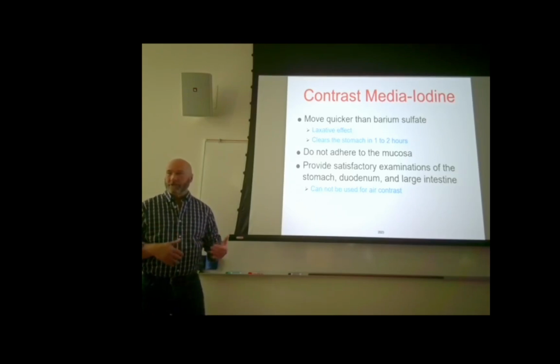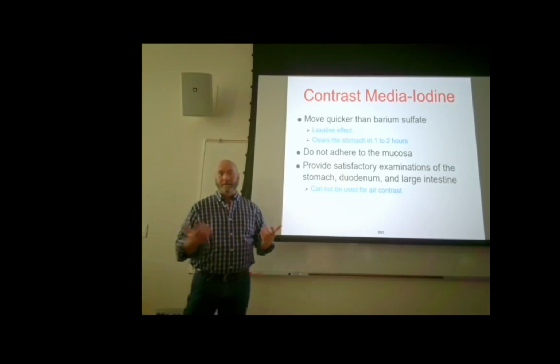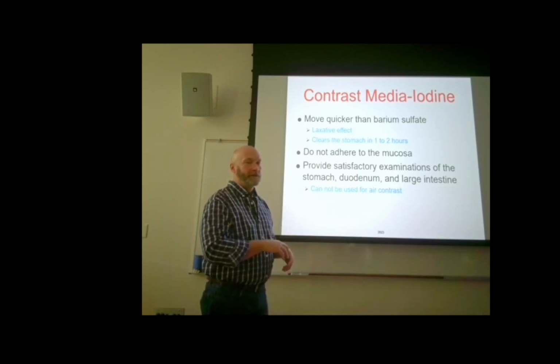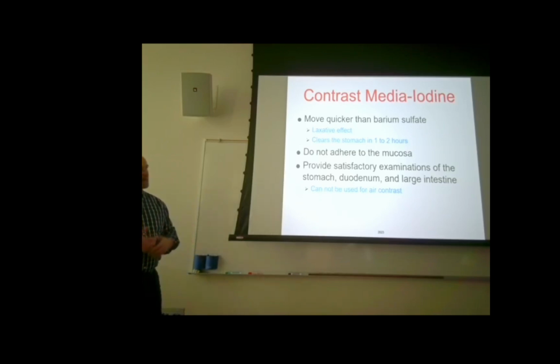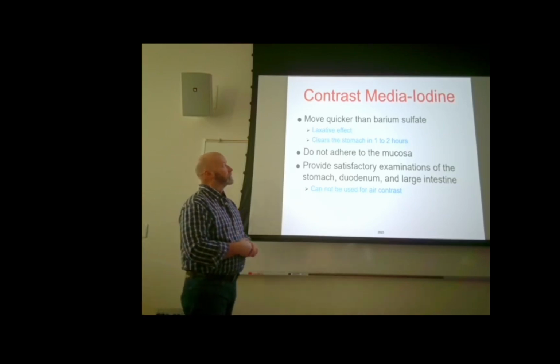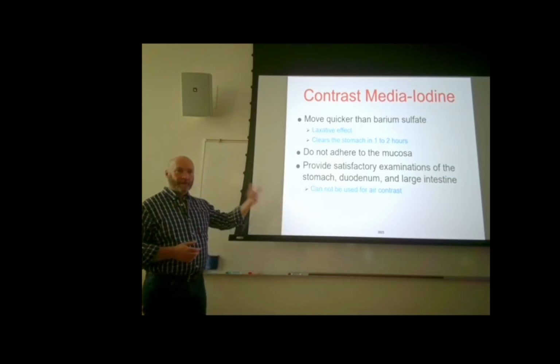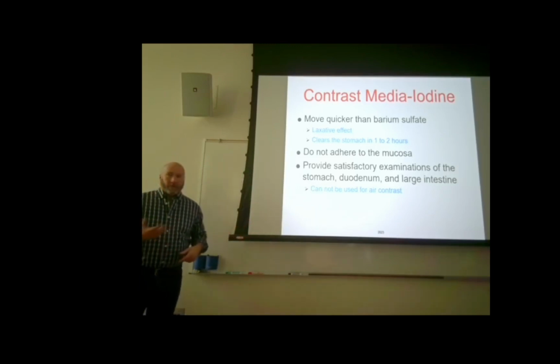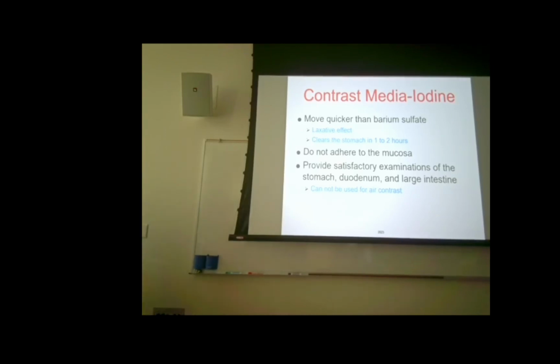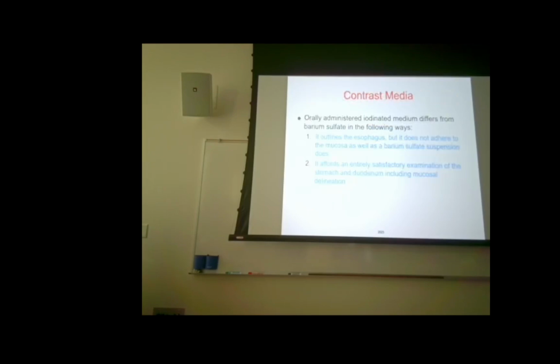It's still dilution of the barium, could potentially give you a worse study, but I've never seen anybody put so much in there that it truly affected it. I'm not sure that it truly affected transit either, so I don't know that it works. So, the iodinated contrast moves through a whole lot faster because of that laxative effect than what barium does, and it cannot be used for air contrast. We already talked about that. Reasons to use air contrast or iodinated.